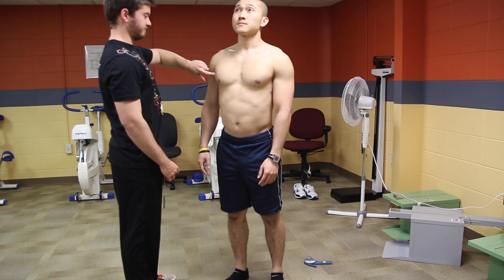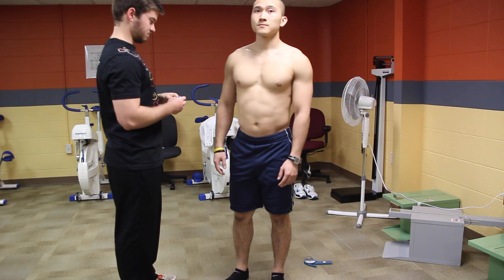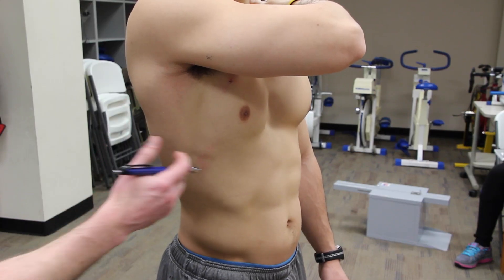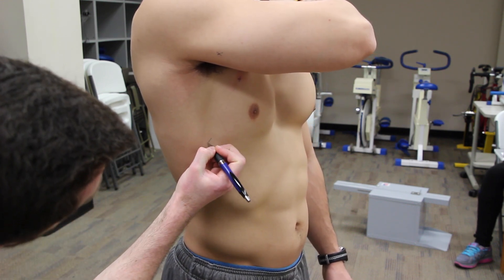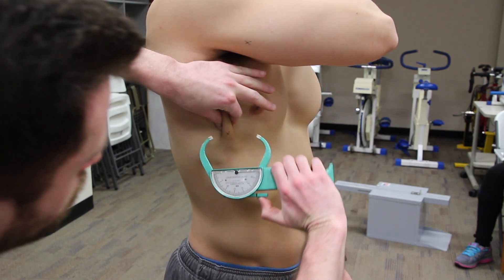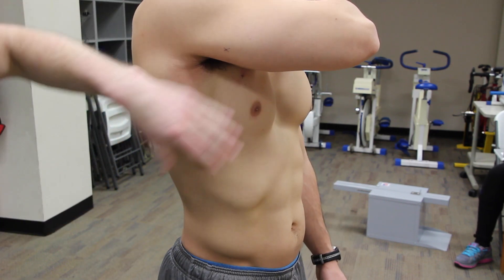After completing the chest site, you will do the axillary site. Have your client grab their left shoulder with their right hand. Obtain the point on the mid-axillary line that is horizontally level with the xiphoid process and mark your spot with an X. Come in with a vertical pinch, obtain your reading and release.